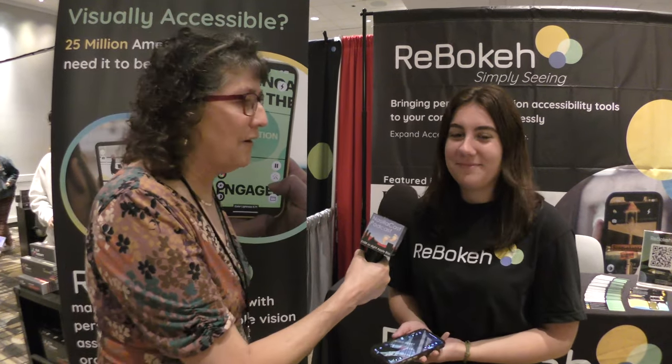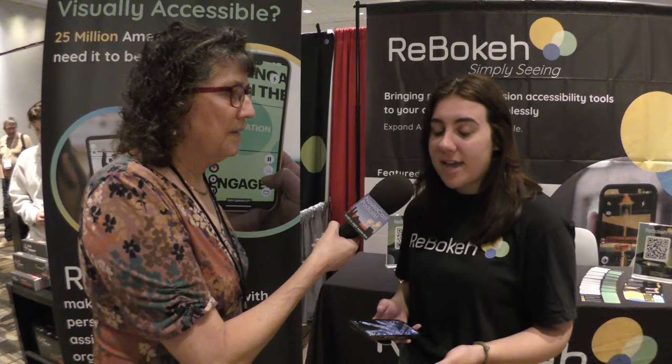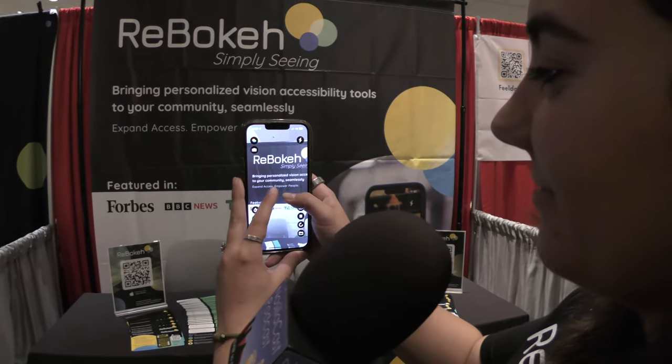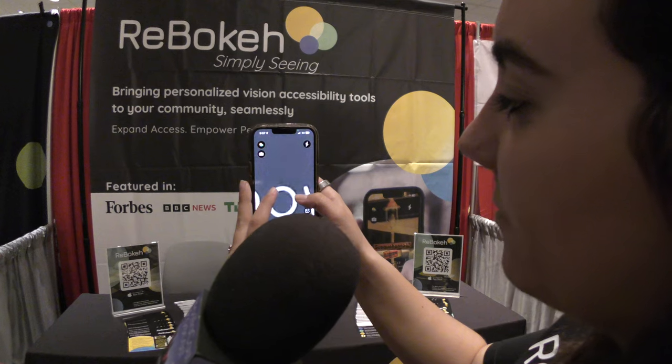She's going to demonstrate it for us — we have a lot of blind listeners and people just listening on podcasts, so describe every little bit of what you're doing. The main feature is zoom — you can pause your images and save them. The zoom is really great because it can zoom in better than the iPhone camera can, and there's also video stabilization so even if you have a shaky hand the camera will stay zoomed in and very still.